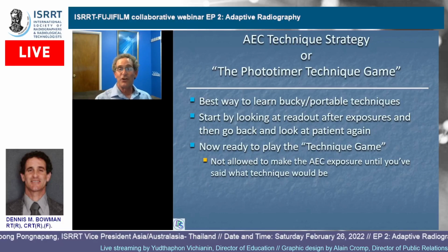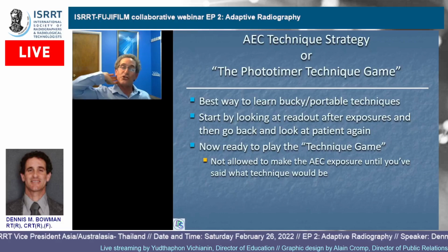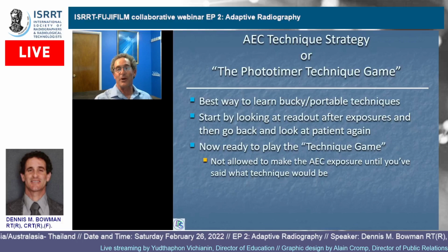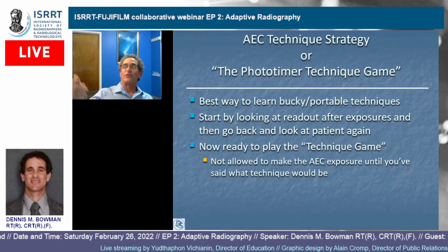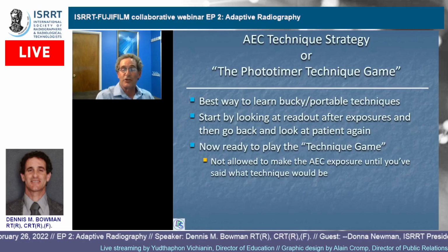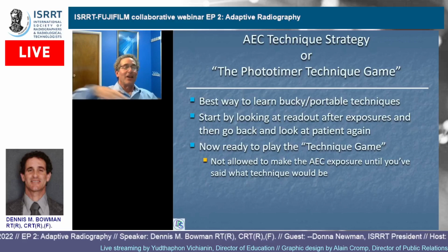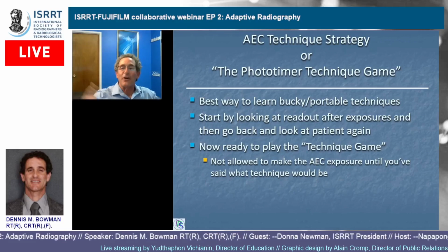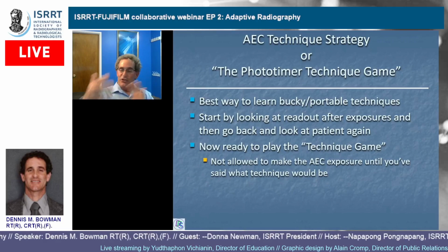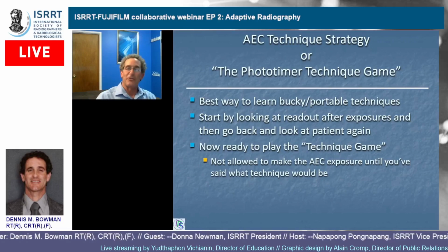And you go, wow, that's super close. And then the EI number was right. The collimation, everything was good. You go, man, that was super close. Or it was 32. And you go, well, I said 16, so I was half of 32. Now, if 32 is right, then your 16 would have been low, and so you would have been underexposed. But maybe it's the other way around, and so, hey, you're double what it should have been, whatever. You don't care. All you care about is that you're making the call, and then you're seeing what's coming up, and then you're learning from it.